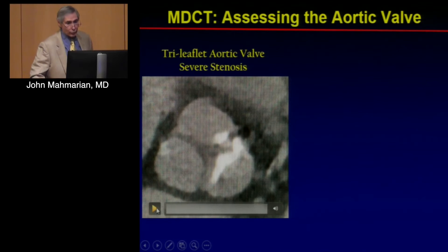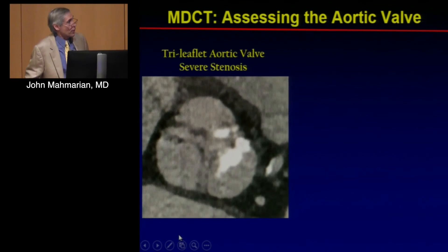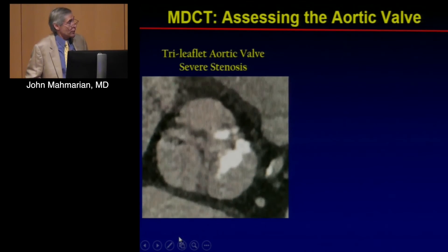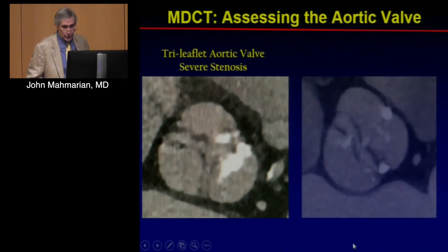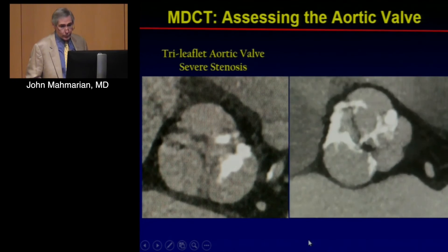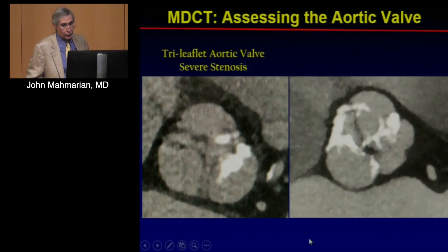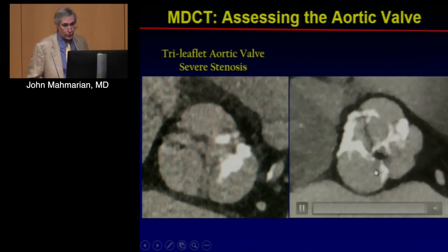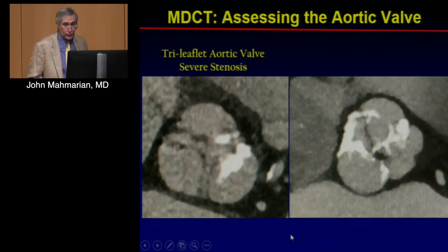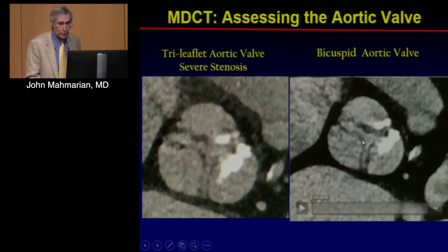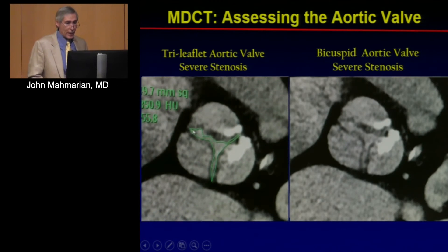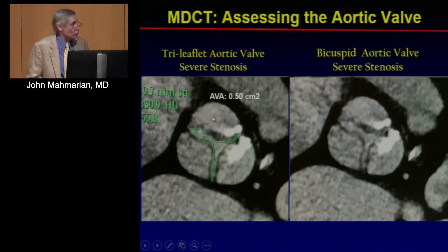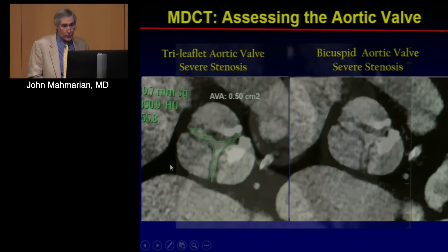We can also specifically assess the aortic valve. Here is an example of a patient with severe aortic stenosis shown in systole and diastole — one with a tricuspid valve and one with a bicuspid valve showing severe calcification. We can planimeter those valves; the valve area in this case turned out to be 0.5 cm², giving us a precise assessment of the severity of aortic stenosis.